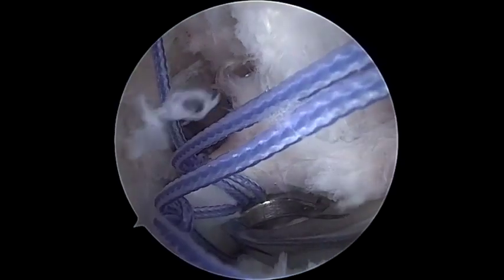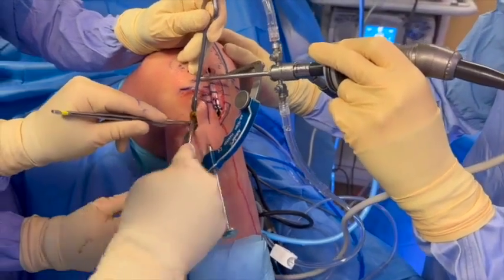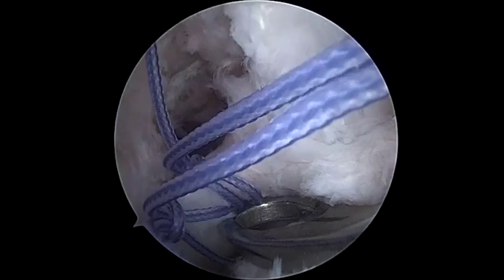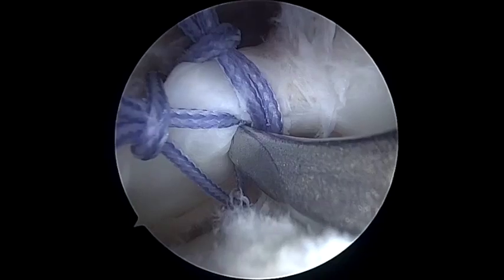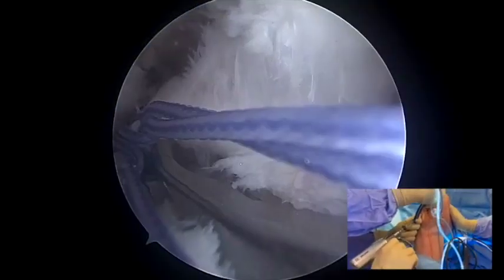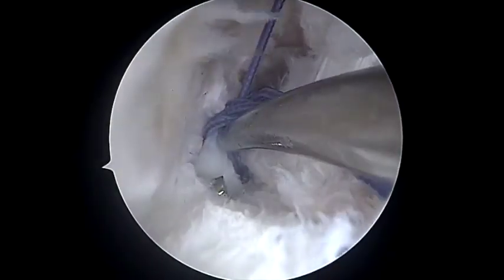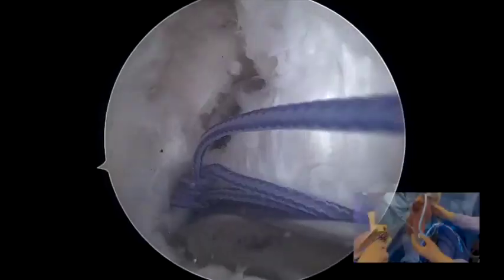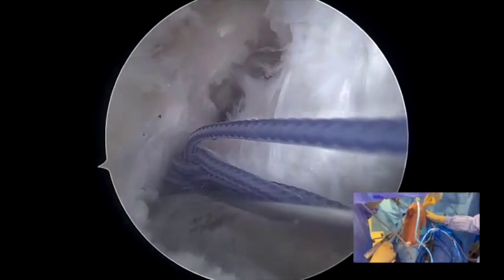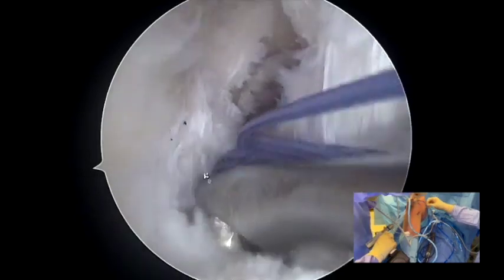With the knee flexed at 90 degrees and the hip in neutral rotation, a small lateral incision is performed and the anterior fibers of the tibialis anterior are elevated from the bone using a cob. The tibial cannula is inserted through the incision. The tibial guide is used to create a tibial tunnel for the suture pullout and is introduced into the joint from the anteromedial portal. The tibial guide is positioned on the center of the root footprint and the 2.4k wire is introduced through the guide from the anterolateral part of the proximal tibia.